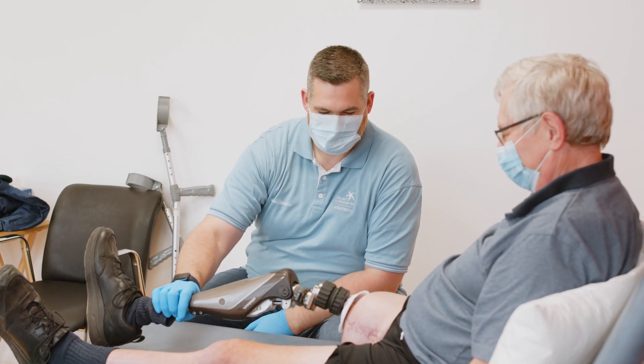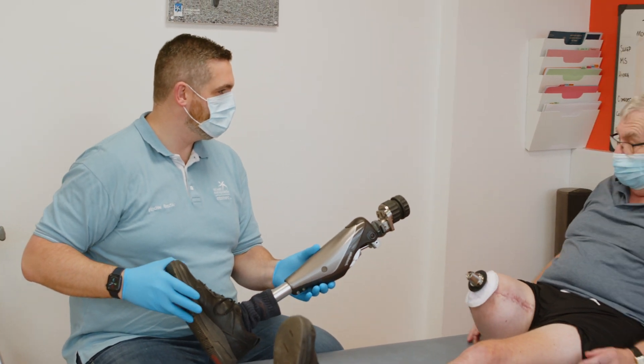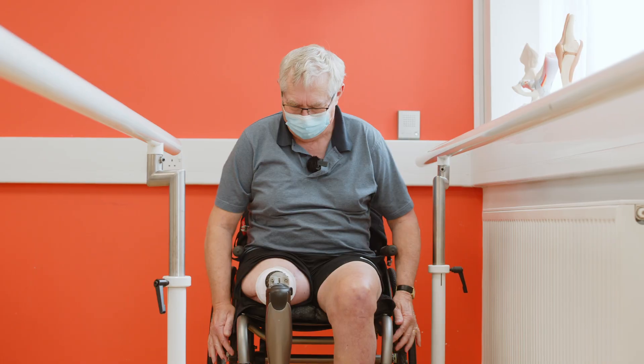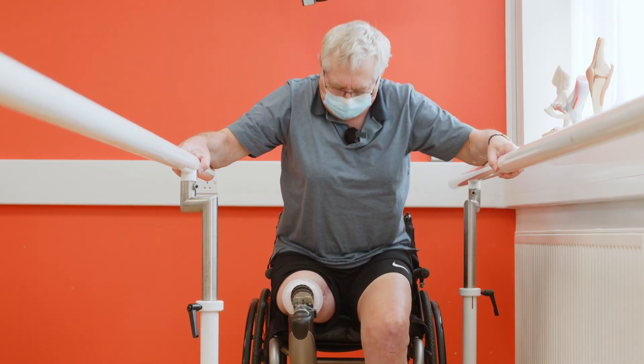Roger's been getting on really well. He's now at the end of his loading phase, so we're ready to get him up partially weight bearing on his leg, which he's very excited about. He's not reporting much pain, his wound looks good as we would expect it to, and he's ready to go.